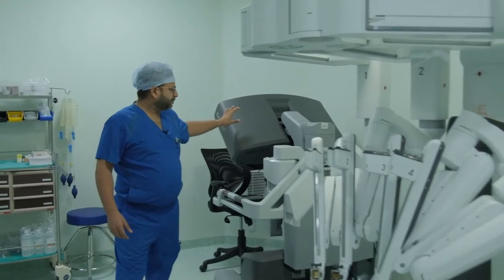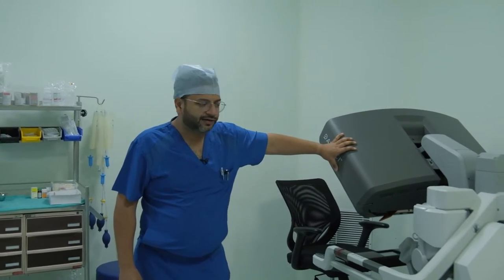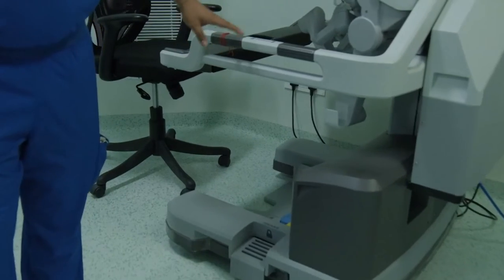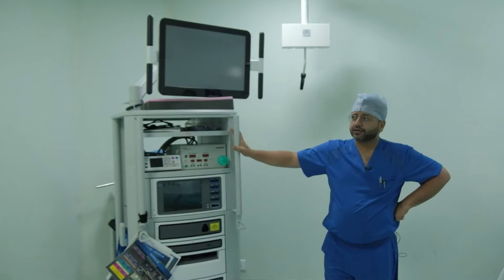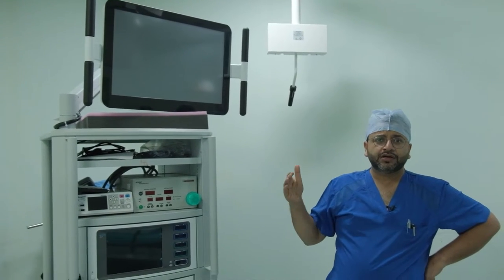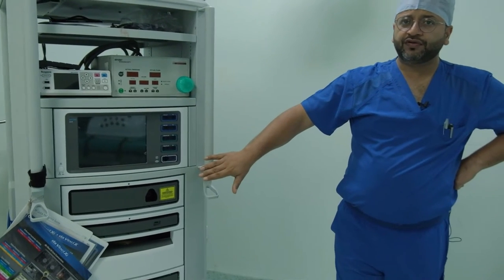This is called the master console. This part is the surgeon console, where the surgeon sits and controls all the movements of the robotic system using these hand controls and the foot pedals. These hand controls and foot pedals allow the surgeon to use just his two hands and control four instruments inside the human body. This is the vision cart, and it allows the assistants to see on the screen what is happening in the surgery. Also, it has inbuilt diathermy and inbuilt video processor unit.